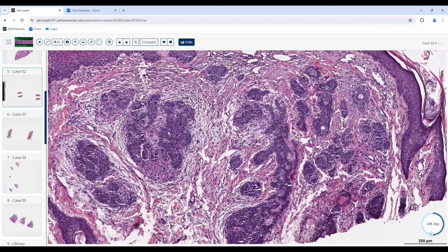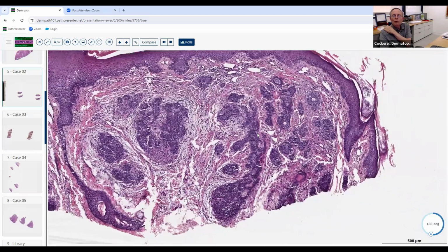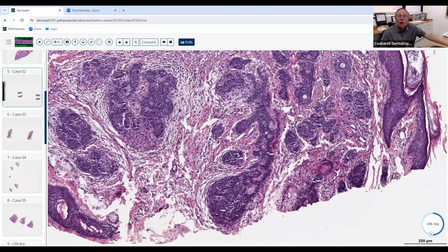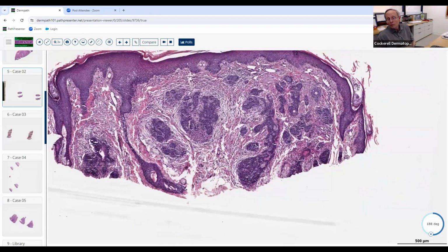So just like the other one, you're going to look down and see things that you might have to choose from. So what else might they put on the board examination to try to trick you when you're making this diagnosis? So they put basal cell, obviously we've excluded that. What else might they put on there?